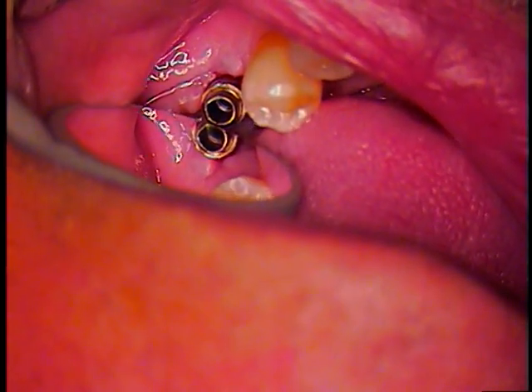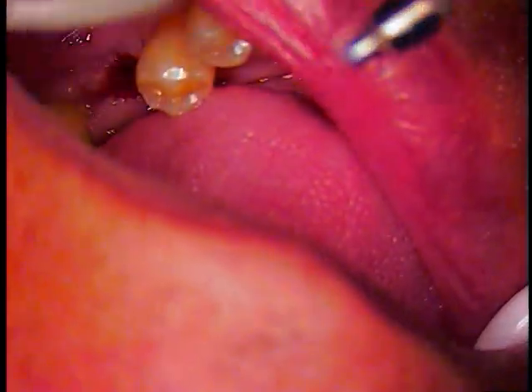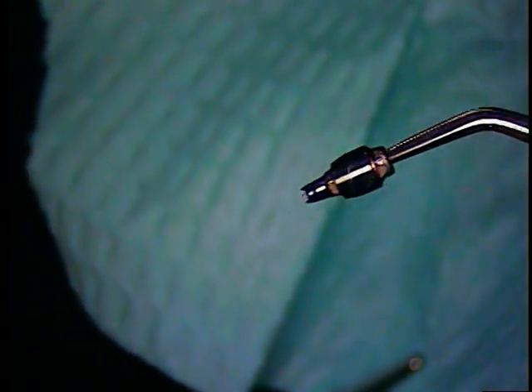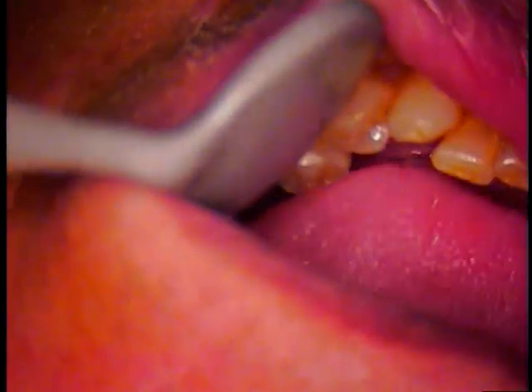We got it. There it is — we've got your abutment. Cotton pliers. There's the abutment — it came out. So we got the first part, folks. That's out. Now we've got to get the fragment out. That's good news — that's Part A. Now we've got to deal with the rest of this. We've got a shaft that's in there.